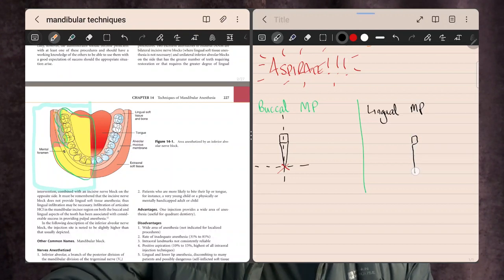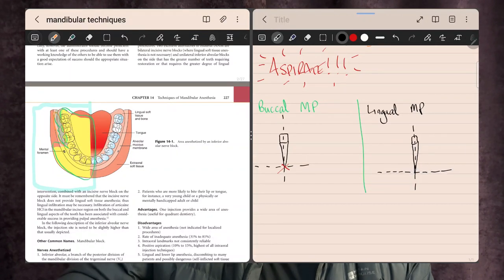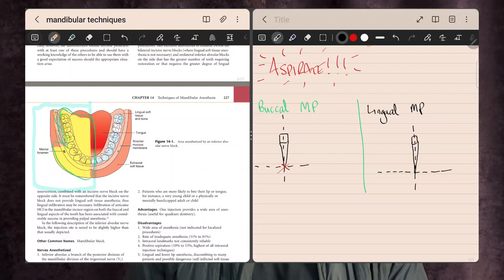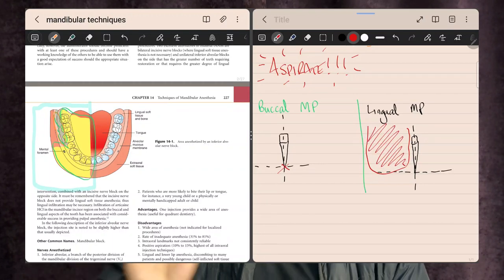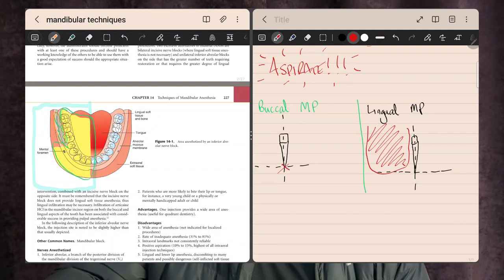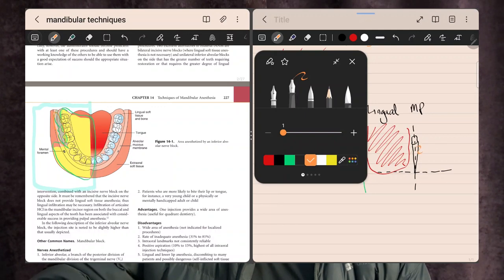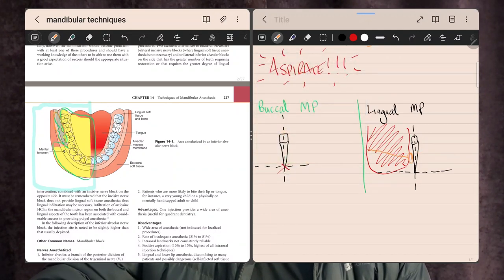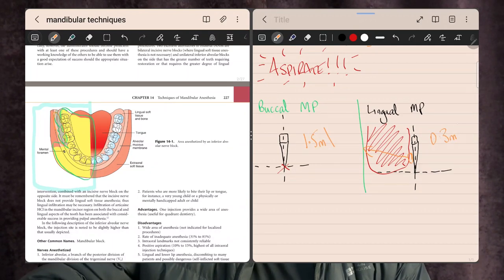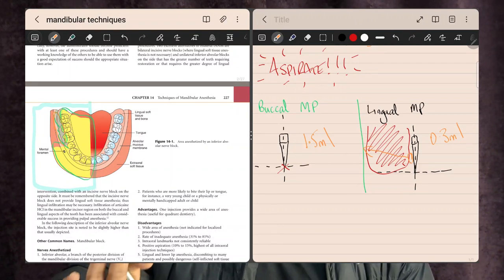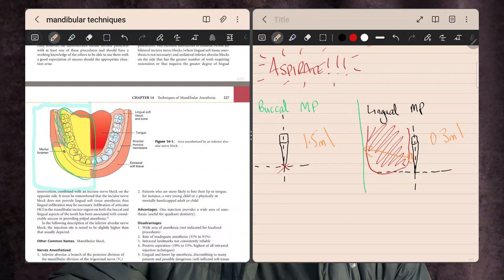On the inside, the y-axis splits the tooth down the middle and the x-axis targets the floor of the mouth. The tongue can be in the way, so the best thing to do is grab a dental mirror, place it there, and retract — moving the tongue out of the way to provide access to the point of insertion. For the buccal muco-periosteum we use 1.5ml of solution, leaving 0.3ml for the lingual muco-periosteum.